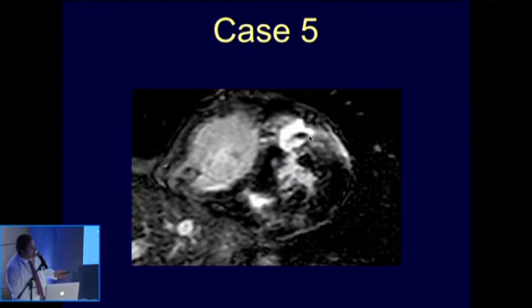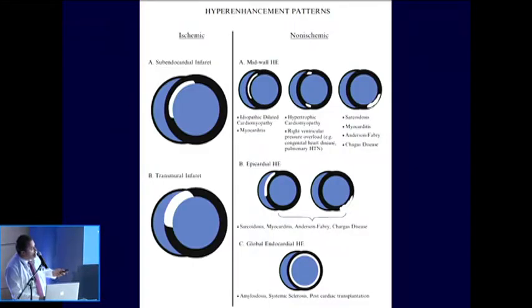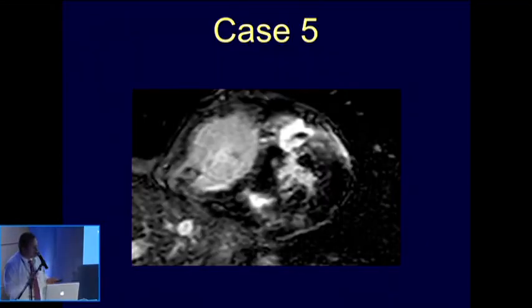We took the patient for late enhancement. And look at the localization of the late enhancement areas, where the left ventricle joins the right ventricle, in the insertion sites of the right ventricle of the interventricular septum. These are the two areas that we saw in the patient. A friend of mine who works for Brockton sent me a number of hypertrophic cardiomyopathies with late enhancement.